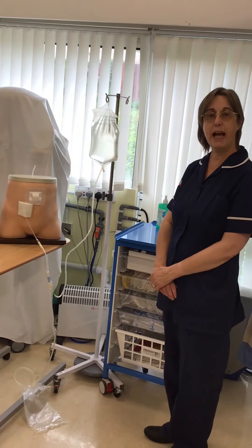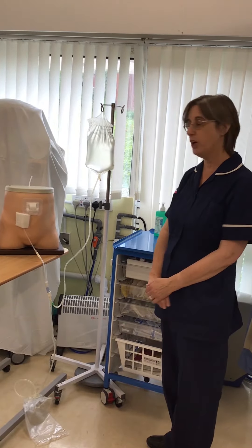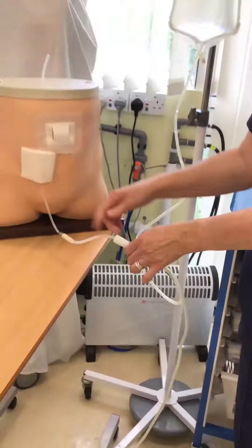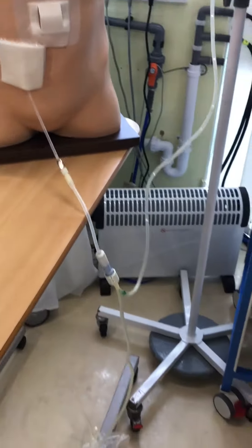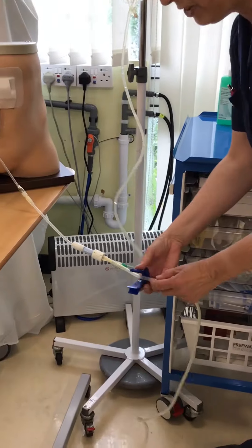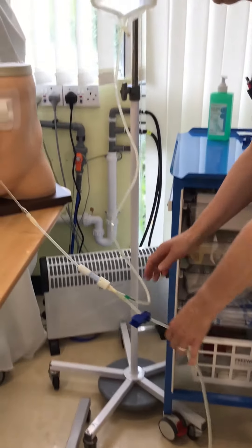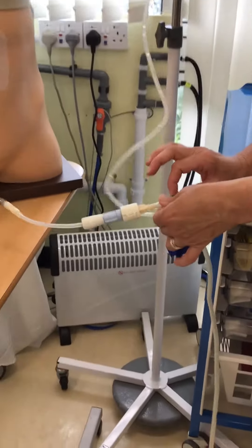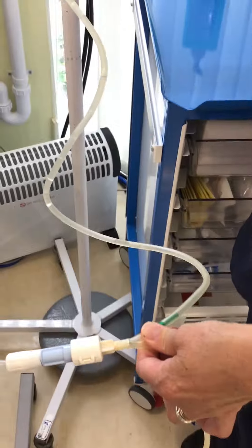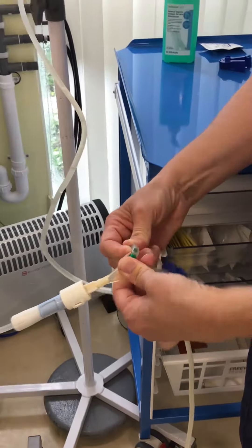You need to allow 20 minutes to drain the fluid out of you. Once you have finished draining, you then turn your twist clamp off, closing the line into you. With one of your blue clamps, you clamp the line down to the bag on the floor. Next, you need to snap this green seal, which will free up the fluid by just applying pressure with your finger and thumb.